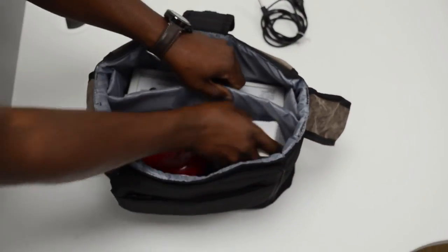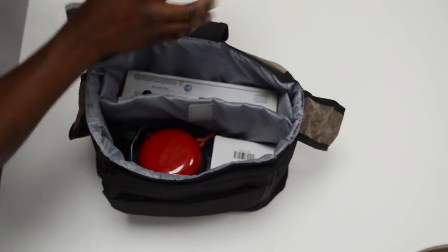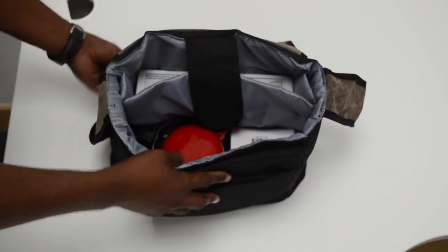Other leads and cables can be stored in the same way, and everything should fit into the carry case as presented here.